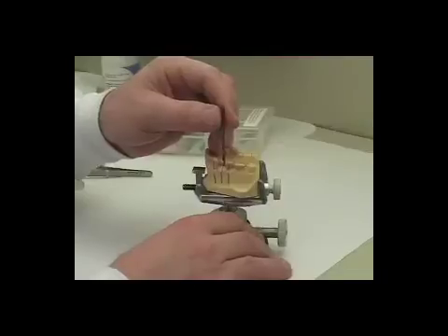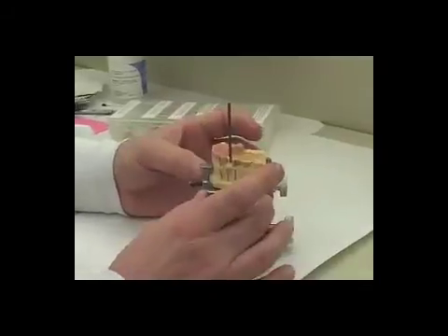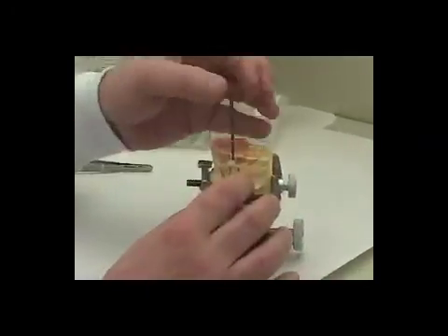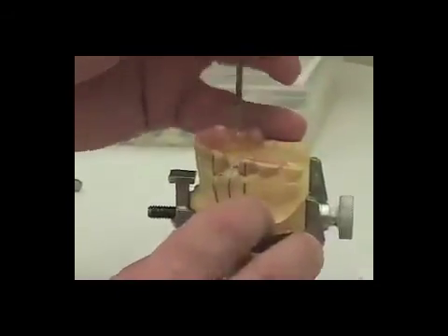We've been at the drill press with our study model clamped in our surveyor table, and we've taken the 2.8 millimeter drill and drilled our hole for the next size surgical guide.